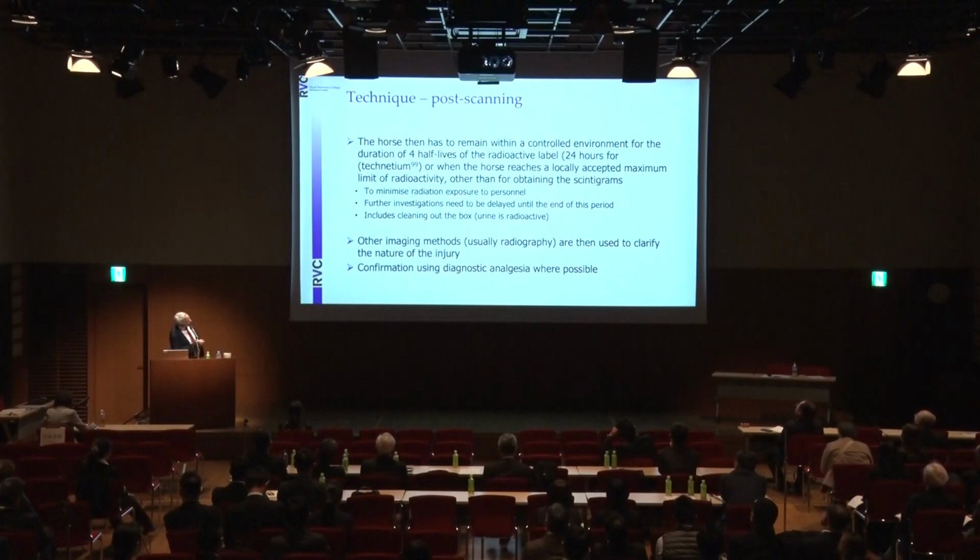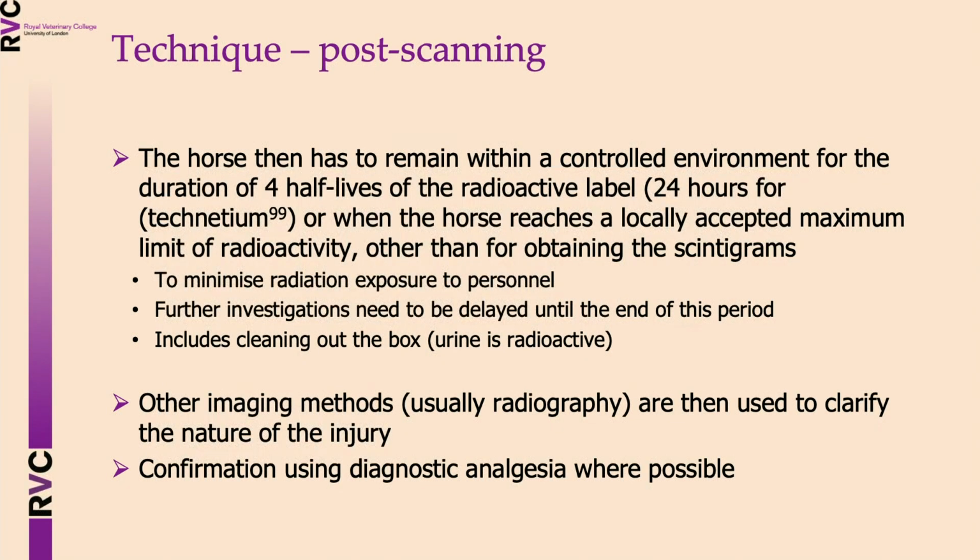Post-scanning, the horse has to remain within a controlled environment for a duration of 4 half-lives of the label, which is 24 hours for technetium. We also measure the horse to make sure that it's decreased to the locally acceptable maximum limit of radiation before doing anything else with the horse.